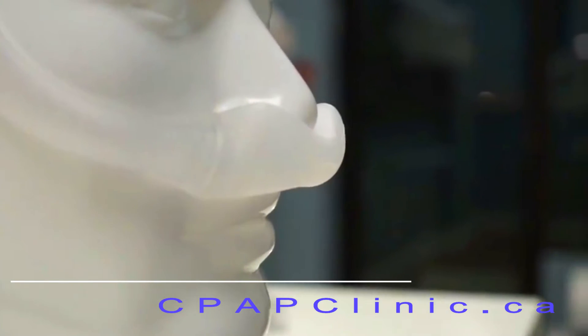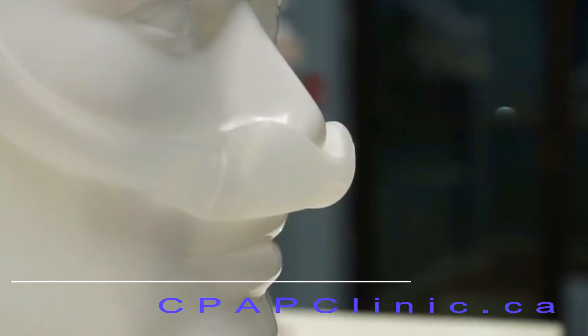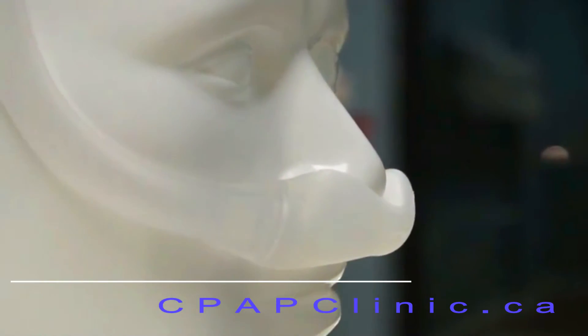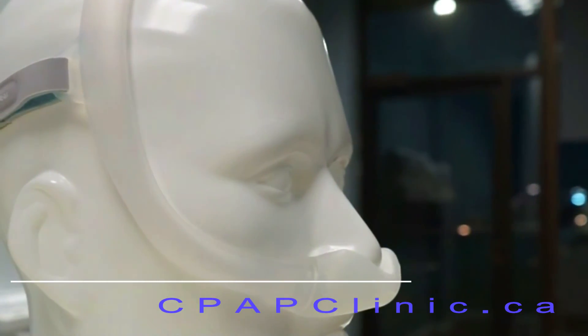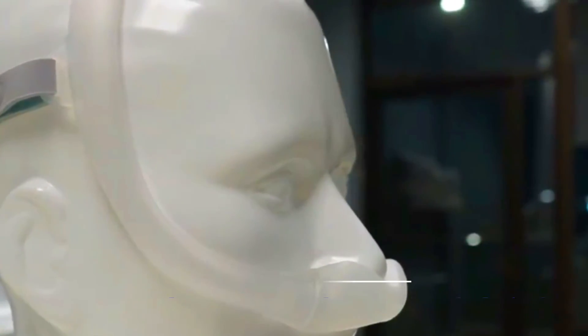Underneath the nostrils is a non-pillows design where nothing inserts into the nose whatsoever. Instead, an opening of small, medium, or large must seal properly underneath the nostrils. In the next segment, we'll talk about the proper fit and how to achieve it.